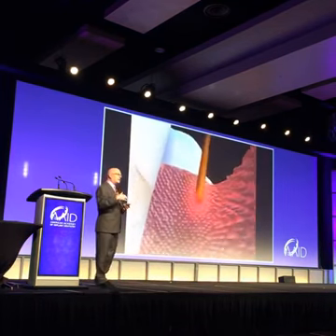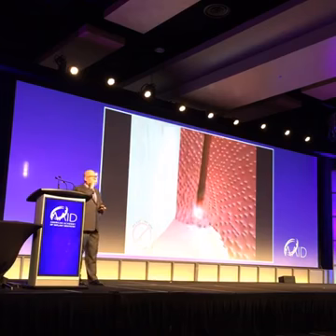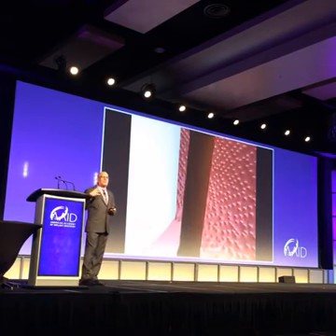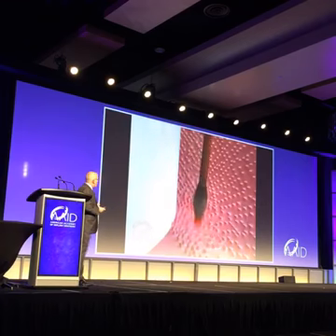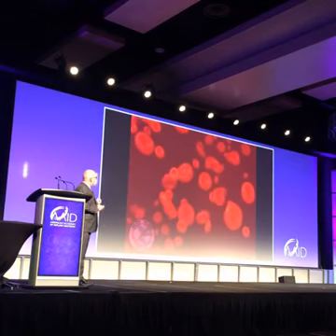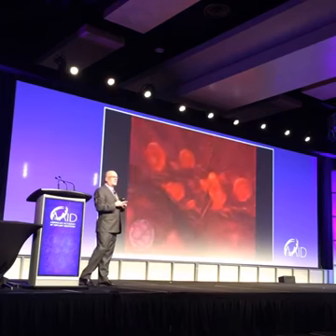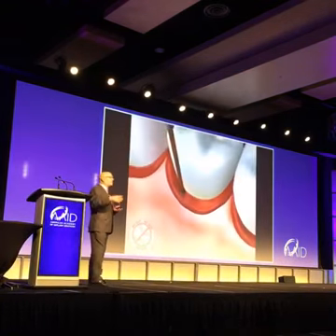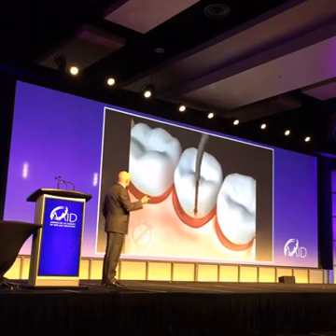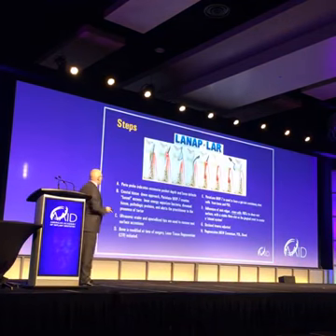Then we use the laser again on a different setting to kill more bacteria and remove what we can. But now what we're doing is trying to develop what we call a fibrin clot. We're splitting fibrinogen into fibrin, and we're getting a clot to form through heat, which allows us to treat patients who are on Coumadin, etc., without having to take them off their medications, which is nice.